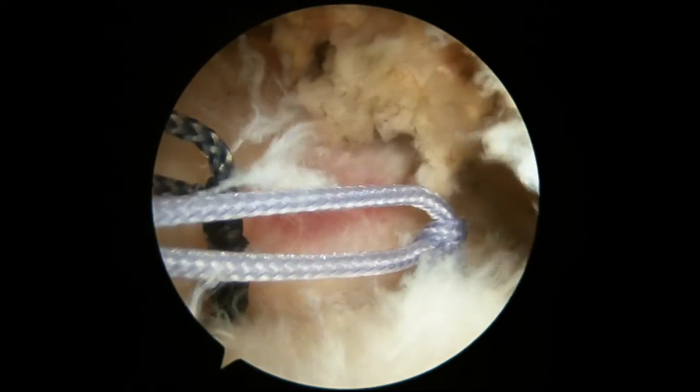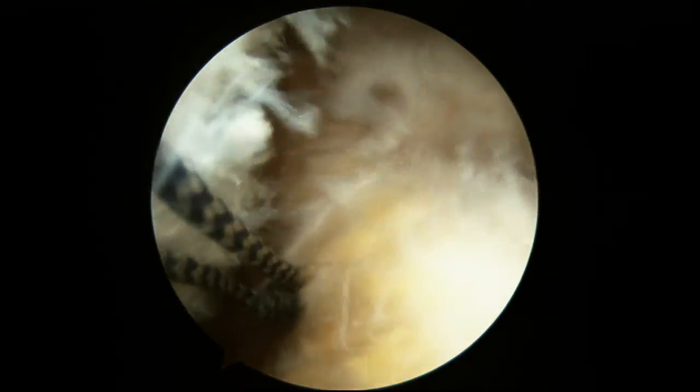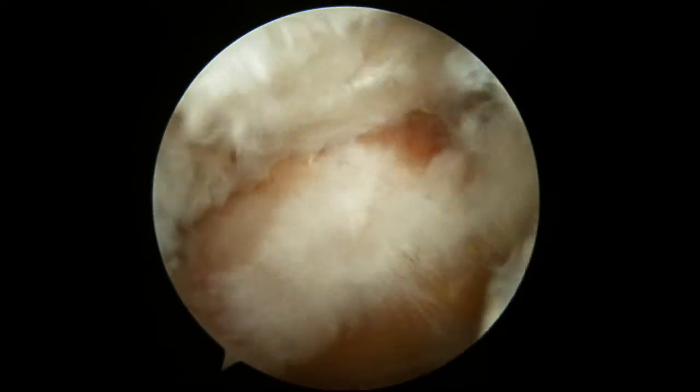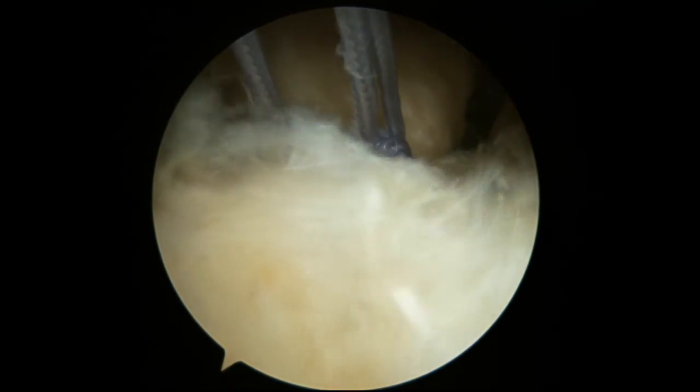Here you can see how we've tied down those sutures on the medial row — all those different color sutures are tied down. But as we come lateral, you can see that the lateral edge of the rotator cuff is still hanging up. We have to fix that.